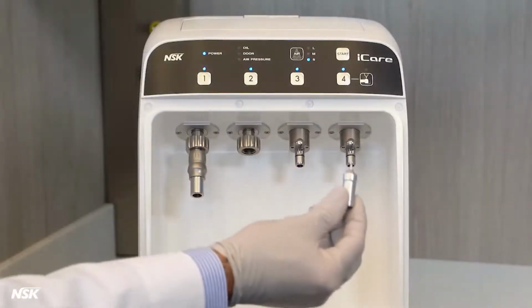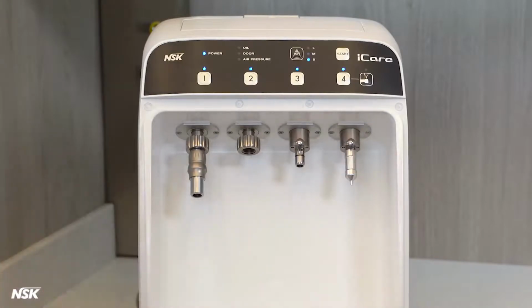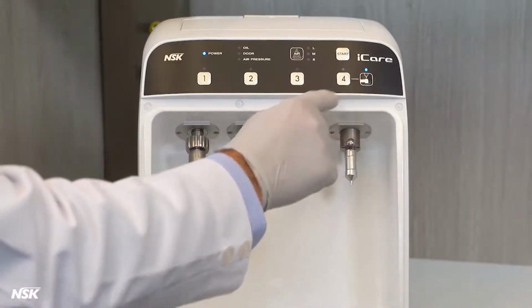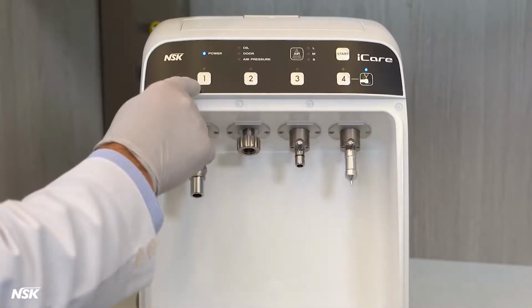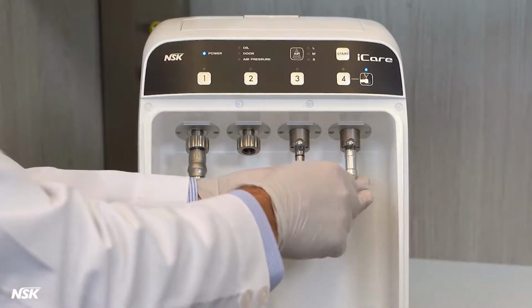Cleaning the chuck is essential, especially for high-speed air or electric handpieces. This step prevents your burrs from getting stuck in the handpiece or your burr running out. To demonstrate chuck cleaning, we use port number 4 and this special chuck cleaning nozzle.